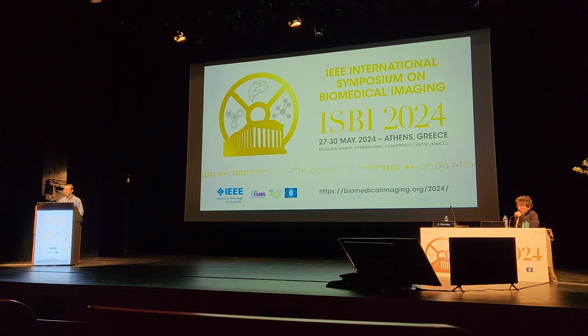Did you collect data from base to apex? Currently, Ninja's work is all from University of Virginia. No, I'm asking if you cover the base all the way to the apex of the heart? The raw data has, but we do not use the very basal and very apical slices because the motion is hard to detect there. Okay, thank you. Thank you very much.